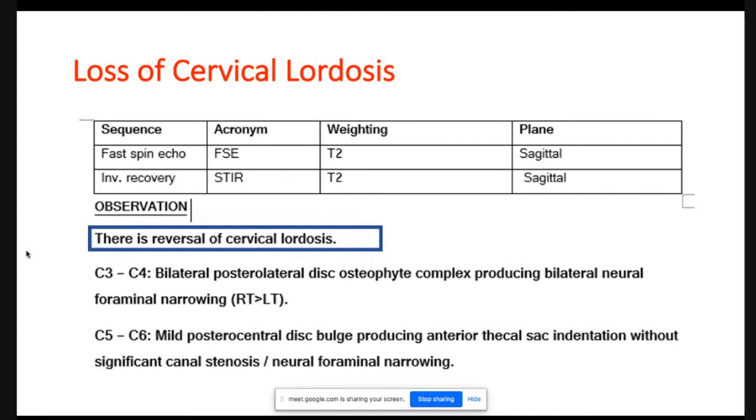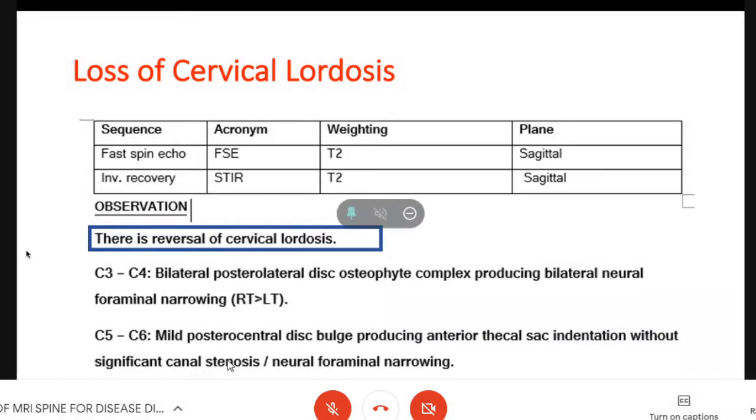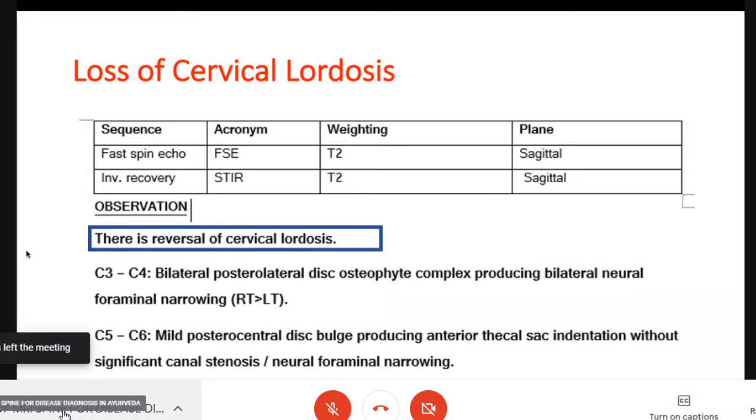Now, your exact clinical examination begins here. Why has this caused the loss of cervical lordosis? What is the reason? Whether the patient is having any rheumatic diseases, any early degenerative changes, any secondary osteoarthritis, whether this patient is a known case of ankylosing spondylitis, meaning a stiff spine that we call bamboo spine. You need to rule out the primary causes and the secondary causes. Even the commonest presentation in loss or reversal of cervical lordosis will be stiffness and a restricted range of movements.